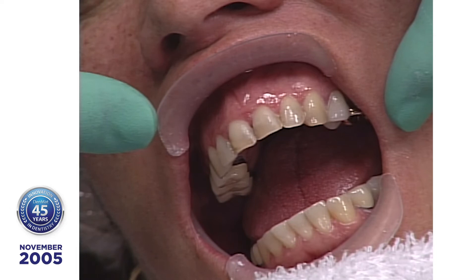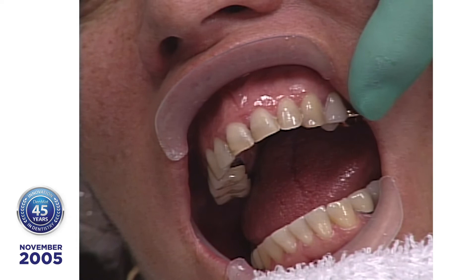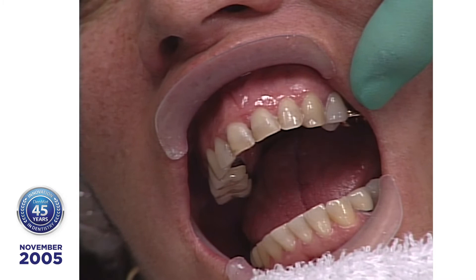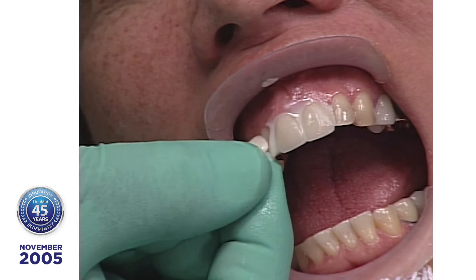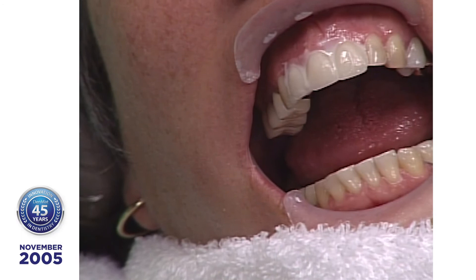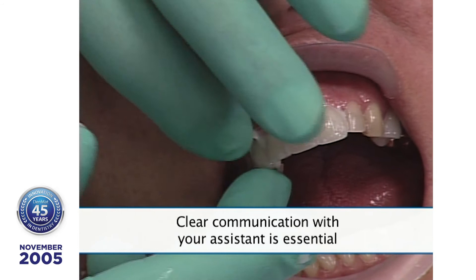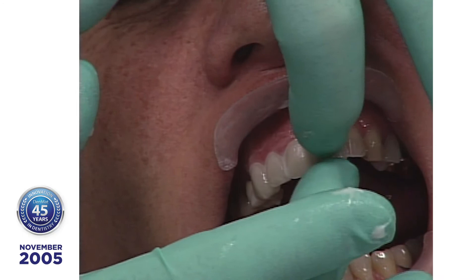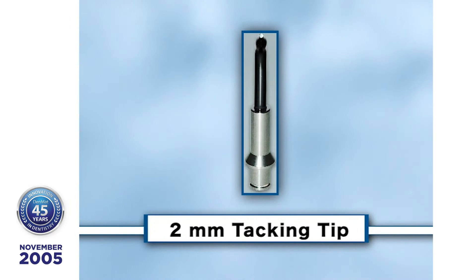The advantage with ultra-bond plus is you've got about 10 minutes of working time if you don't put the light on it. If you put the light on it, you get instant polymerization. Left central, right lateral. So you see this really isn't too complicated. Cuspid right, left cuspid, right cuspid. Always repeat what your assistant gives you and confirm what you think they said. Now before I get to the left side, I'm going to take the two-millimeter tip on the sapphire light.